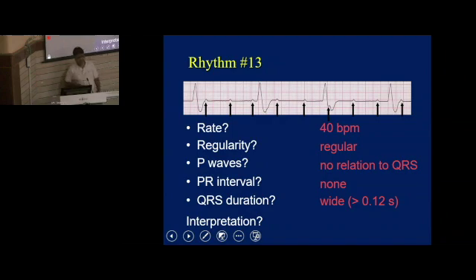So what is the diagnosis? Diagnosis: third degree atrioventricular block, or complete heart block. And in this, we discuss one problem that is called Stokes-Adams syndrome. I think I told you about this before also.